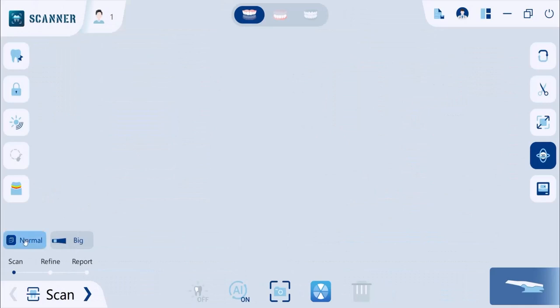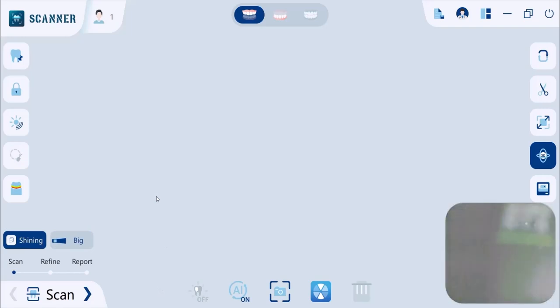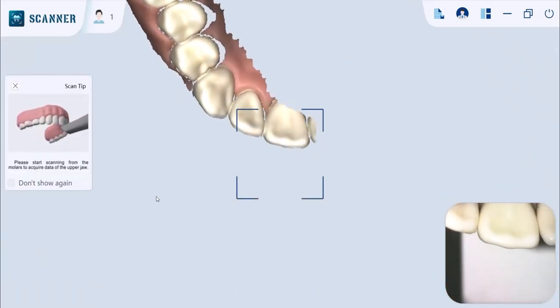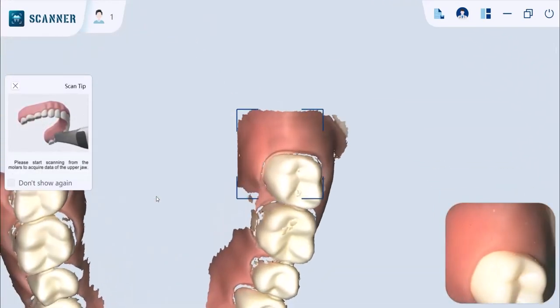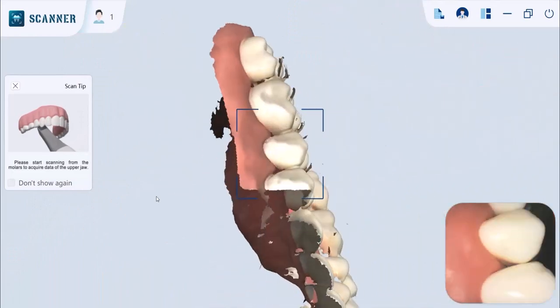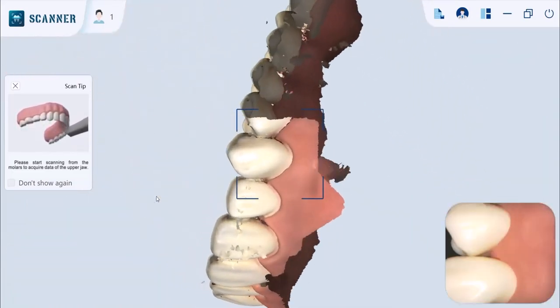Before you start scanning, make sure to eject saliva and blood to make the teeth surface as dry as possible. To start scanning, press the start button on the scanner and adjust the scanning tip parallel to the occlusal surface. Keep the lens about 4mm away from the teeth surface and make sure it is centralized. Then start leaning about 60 degrees to the lingual surface and the same for the labial surface.